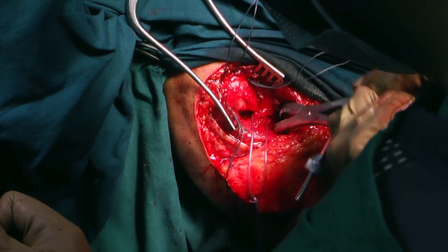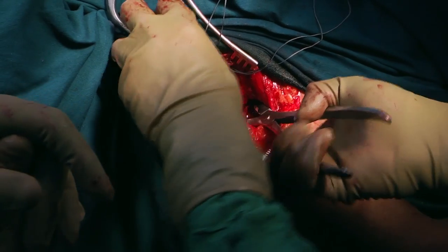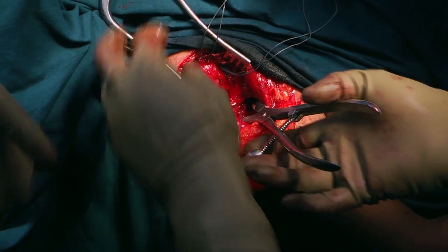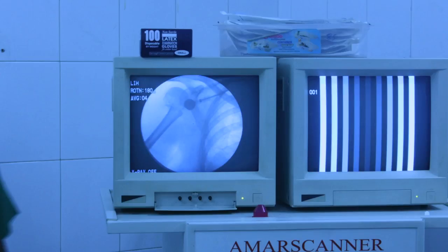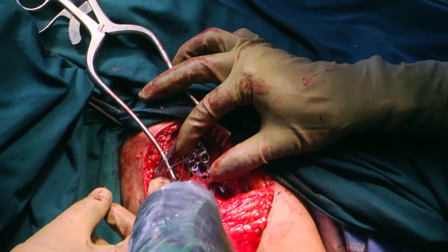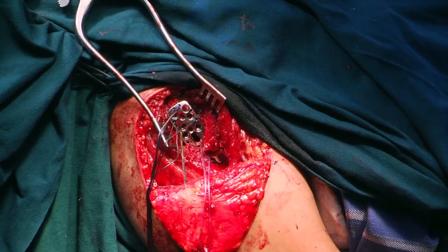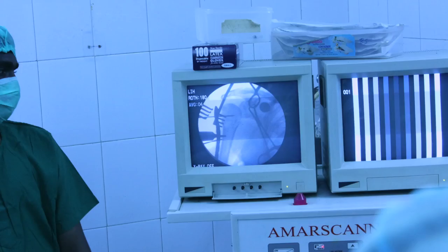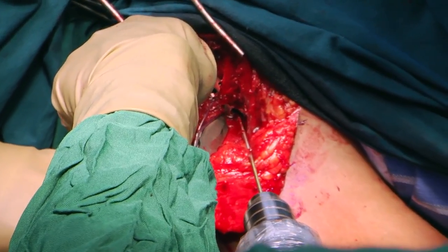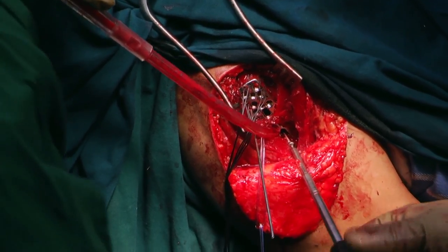A similar 2-part fracture can also be reduced by using an AO reduction clamp. In cases with significant medial shaft displacement due to the pull of the pectoralis major muscle, a 3.5 mm cortical screw can be placed as a reduction screw through the proximal oblong hole of the distal segment of the PHILOS plate. This screw is used to pull the shaft under the humeral head. Care should be taken not to pull the shaft too laterally, which will leave the humeral head unsupported on the medial side.